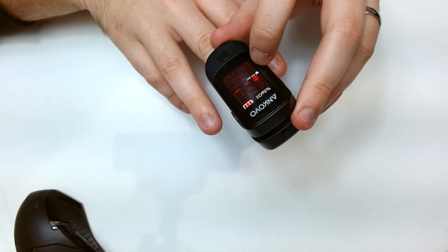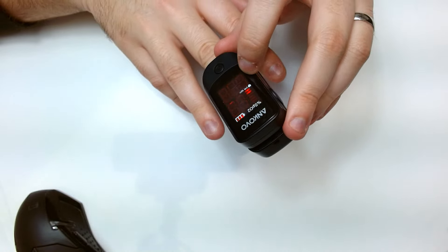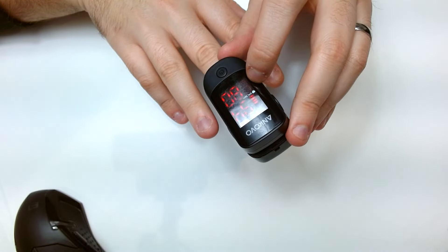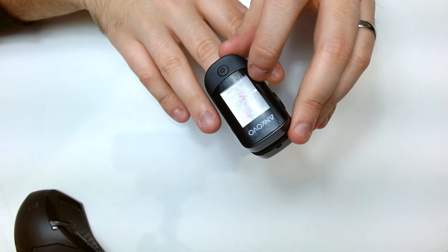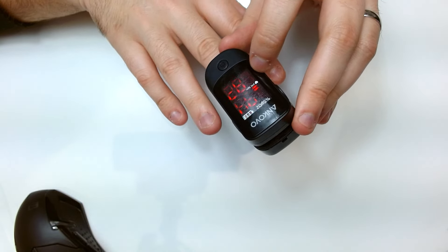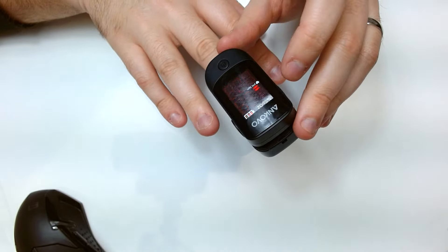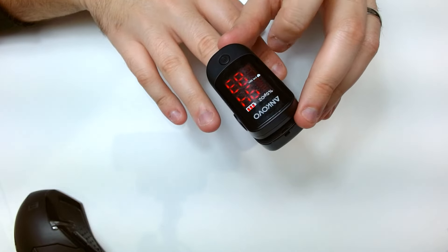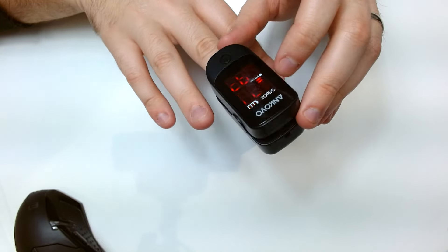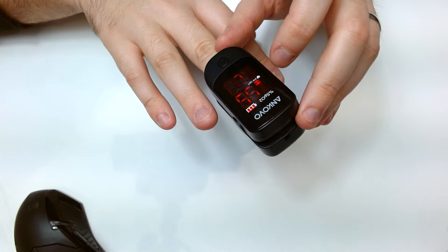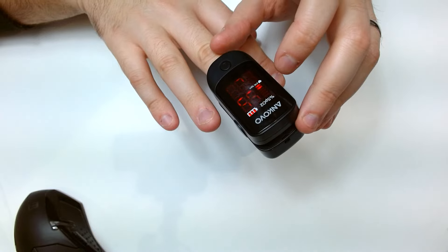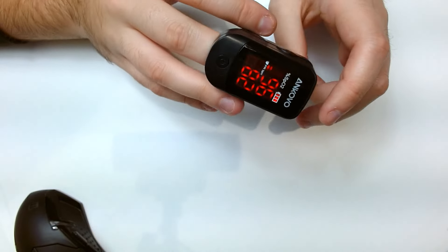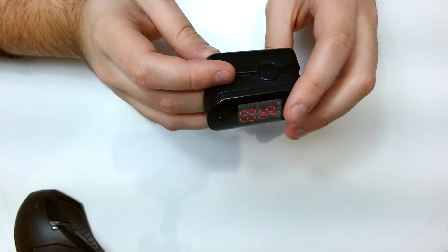And I've actually compared this with doctor's oximeters which are considerably more expensive when I've gone in and the results are practically the same so it's pretty reliable.